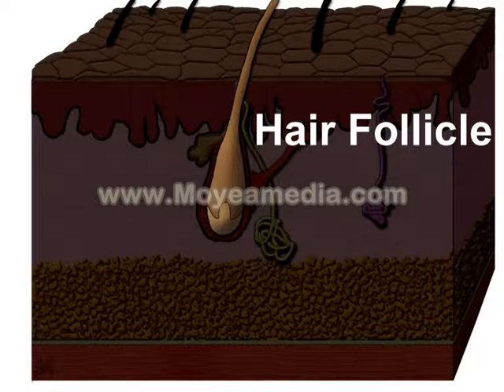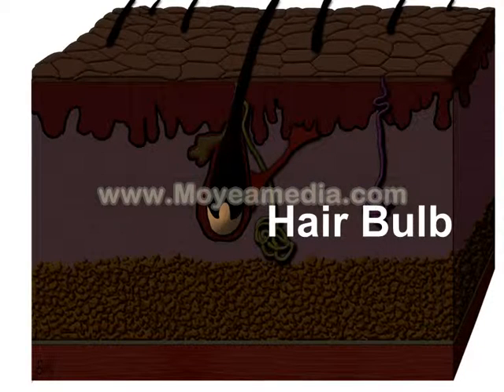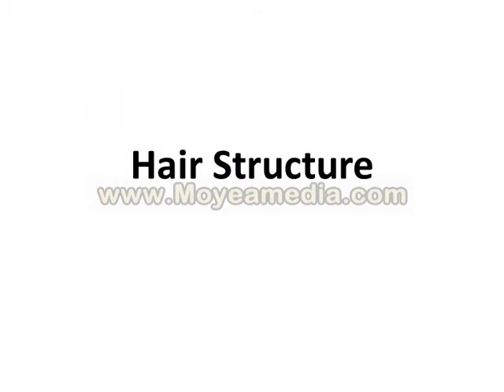The follicle is noted centrally, surrounded by a follicular sheath. The hair bulb is the lowest portion where the germinative epithelium resides. We'll look at the structure of the hair.